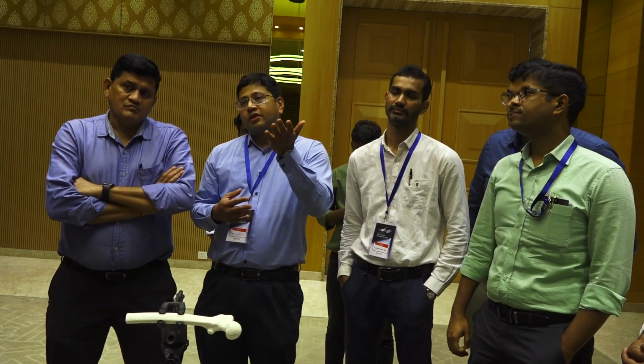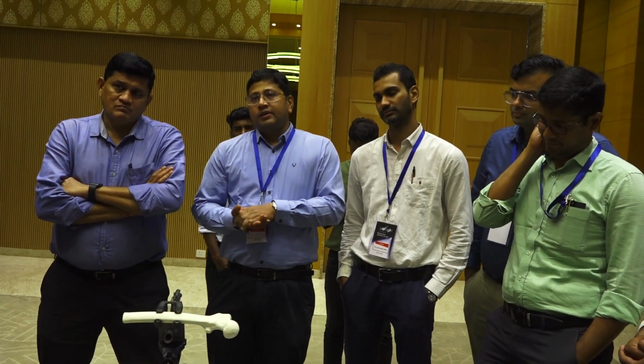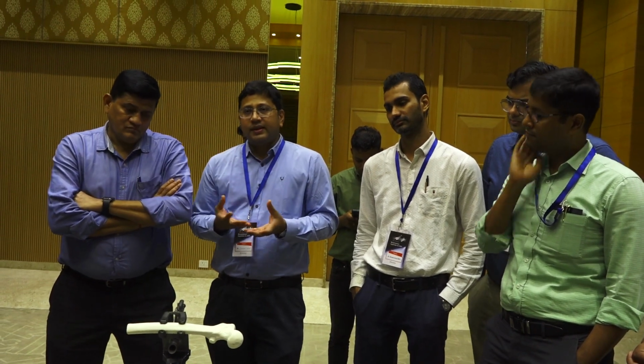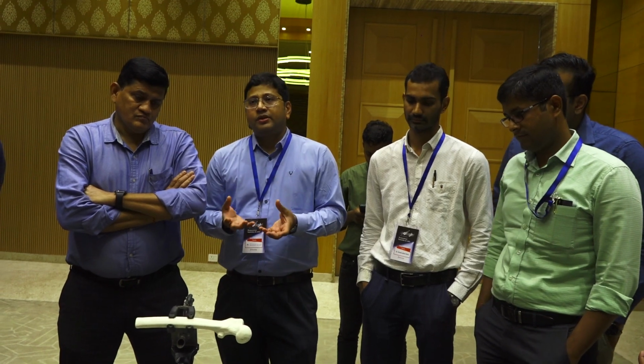The lateral view. Also, you have to see that the anterior and the posterior cortices are matching with the shaft. So these are two key points. If we are unable to achieve a reduction by closed means, then sometimes we need special kinds of instruments to achieve reduction.